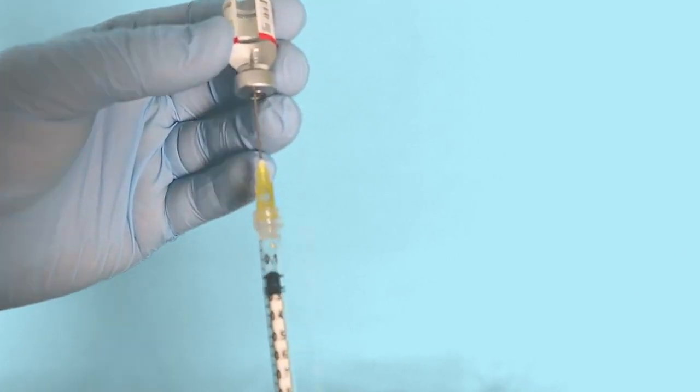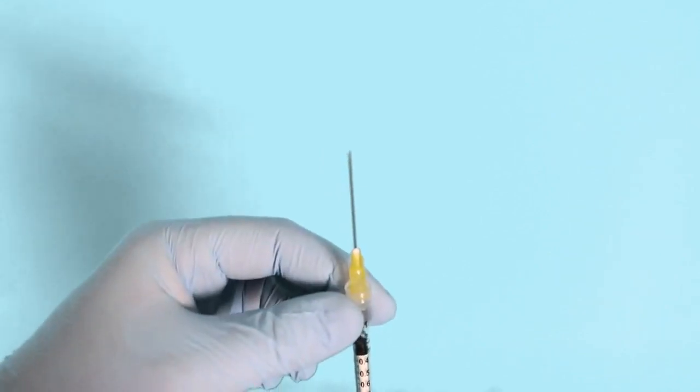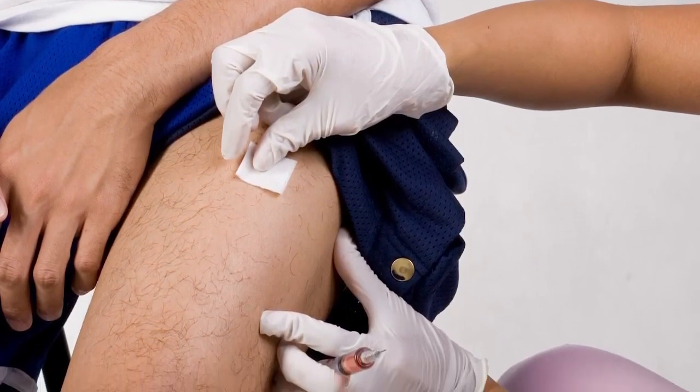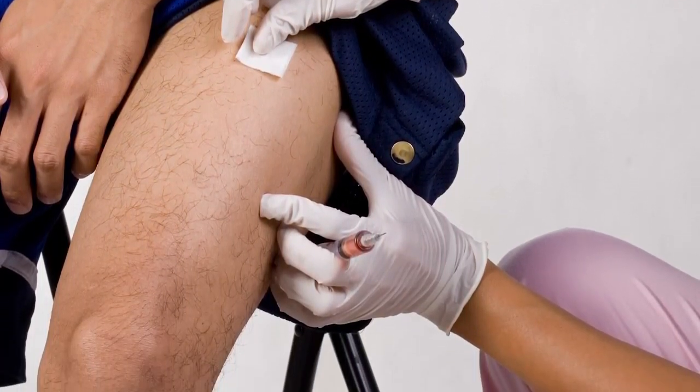Lastly, make sure you express any air before administering an injection. The appropriate injection route for epinephrine 1-1000 is intramuscularly or subcutaneously into the anterolateral aspect of the thigh, which is midway down the side of the thigh.